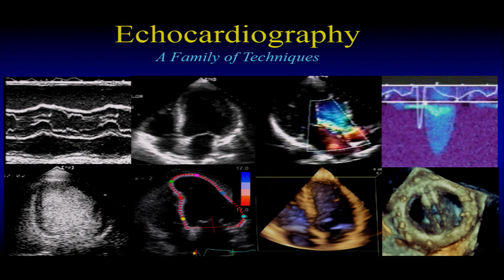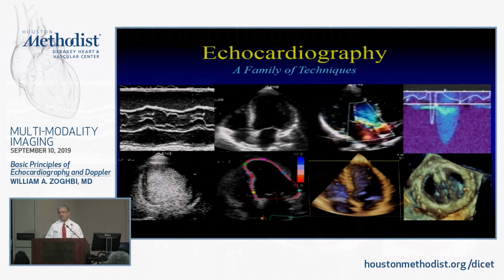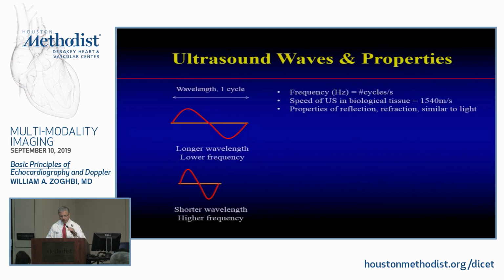We've evolved into a family of techniques, still using the same principle of sending an ultrasound beam or packet of sound reflected back from the surface of whatever structure you're looking at, and then characterizing it one way or another, first in space, and maybe function, and many other things that we'll talk about today. So it really has evolved into a family of techniques of Doppler, 2D, 3D, and you name it. So let's go through the principles here so we ground ourselves in some of these.